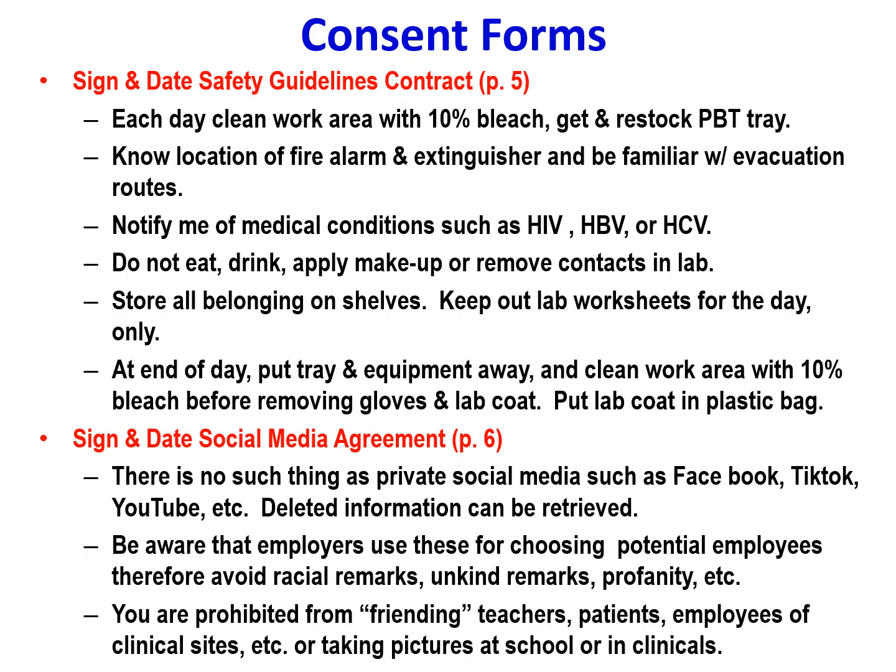We will go over the safety guidelines in the lab, including cleaning your work area, restocking your tray, being able to understand where your fire alarms and extinguishers are, and knowing your evacuation routes. If you have any medical conditions such as HIV or hepatitis B or C, let me know about it. We do not eat, drink, apply makeup, or remove contacts in our lab class. And we will go over where you store all your belongings to keep our work area safe.